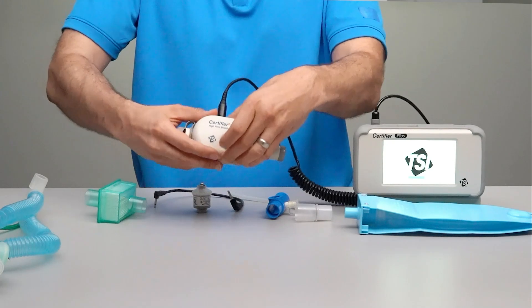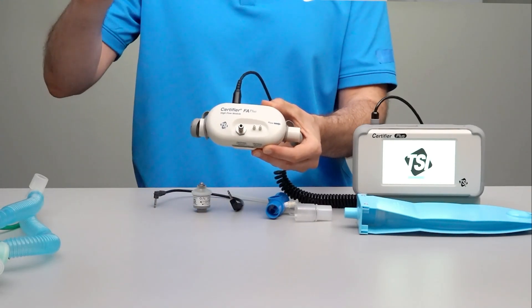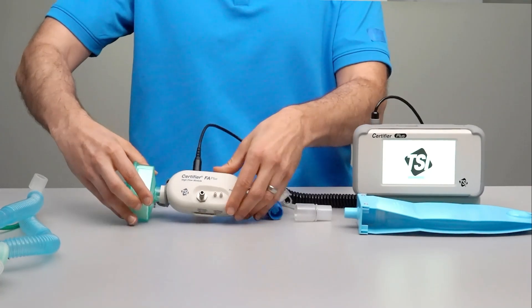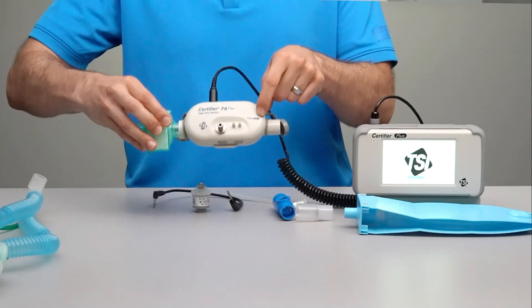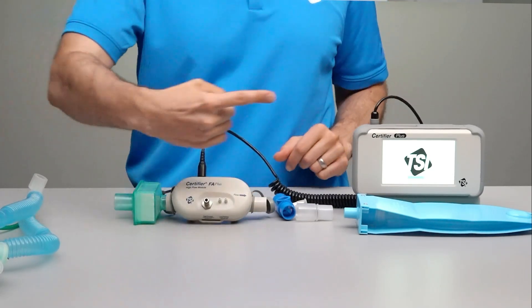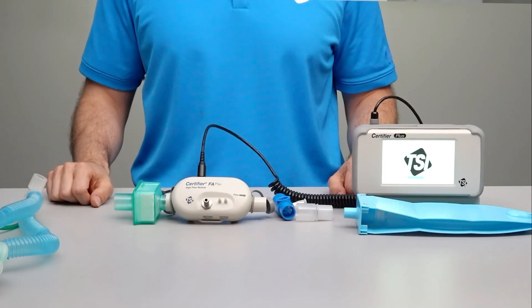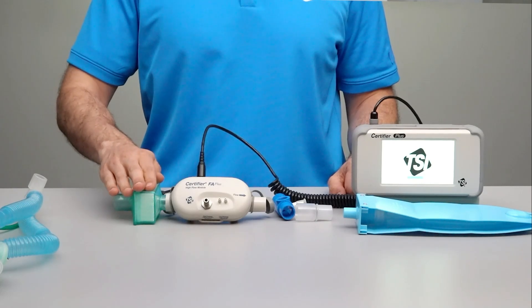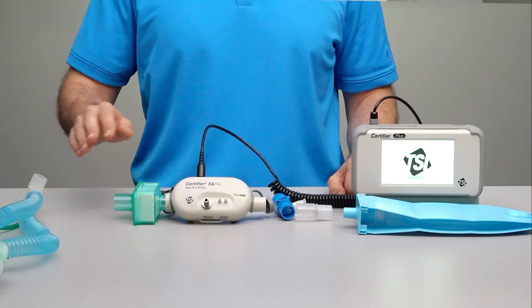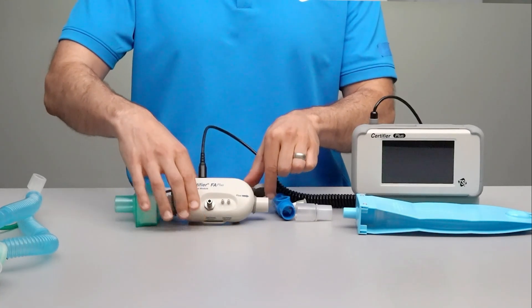Uncap the ends of the flow module and connect the filter to the inlet. There's an arrow printed on the front of the flow module to indicate the forward direction of flow. To protect your Certifier Flow Analyzer, it's important to always operate with a filter upstream of the flow module and to cap the ends when not in use.